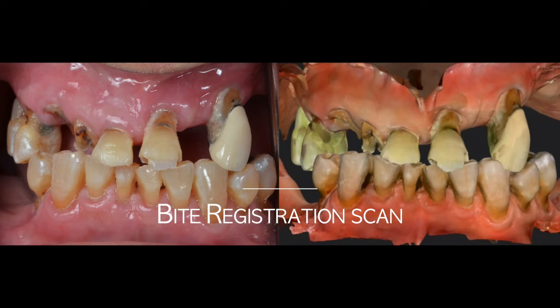The last one for the intraoral scanning is the bite registration scan. You only need to scan the facial surface from tooth 6 to 11, covering maxillary and mandibular teeth together. The scanner will orient the maxillary and mandibular arch scans correctly according to your bite registration scan. And this will be the completion of intraoral scanning for any removable prosthesis.